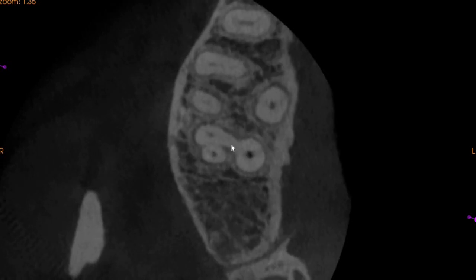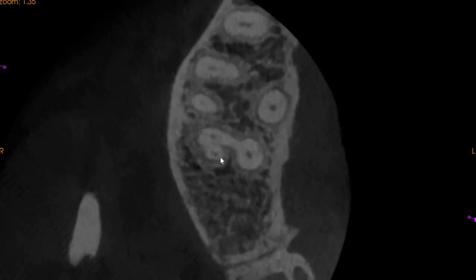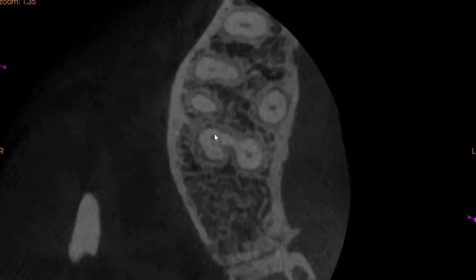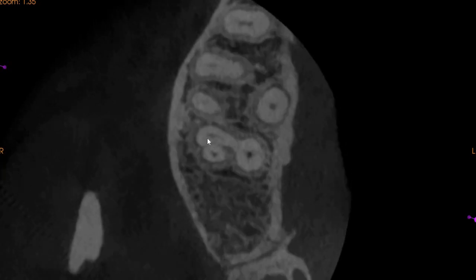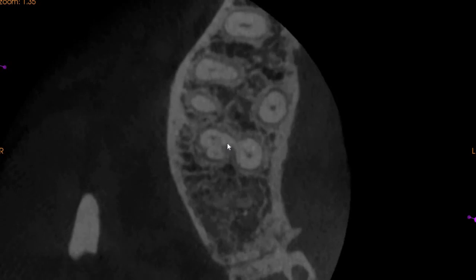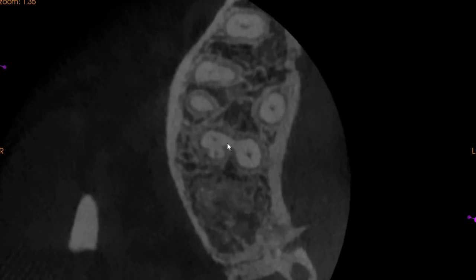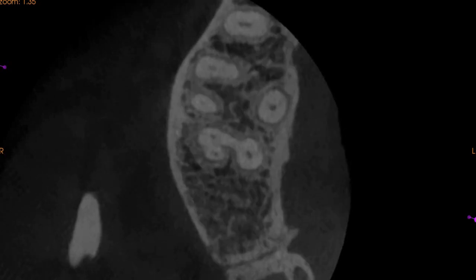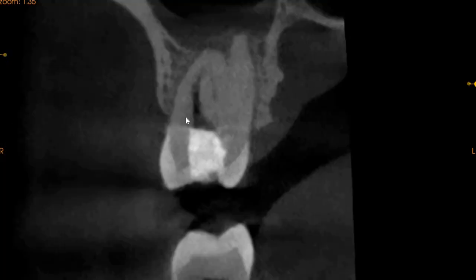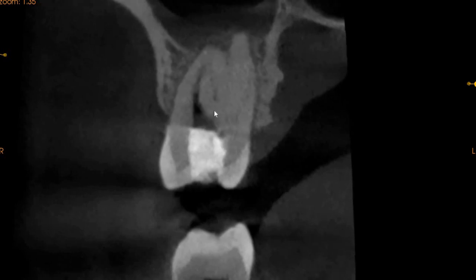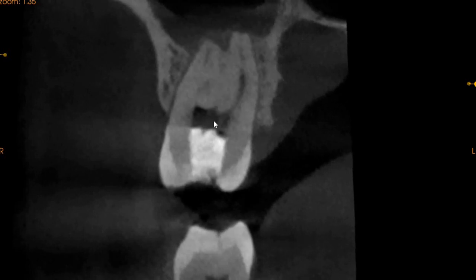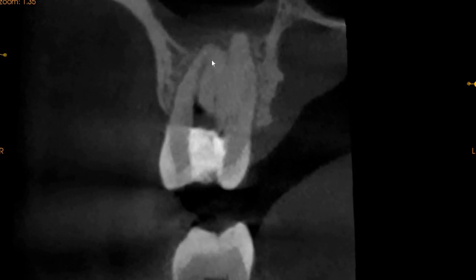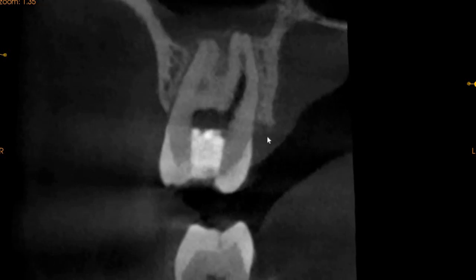As we move down, we can clearly see that all four canals have separate apices. However, the MB1 and MB2 — their canals meet right close to the apex. On the coronal view, we can see the MB1 and a very faint MB2, but the MB2 is clearly present. The MB2 joins the MB1 close to the apex and exits as one. We can also clearly see the palatal canal.